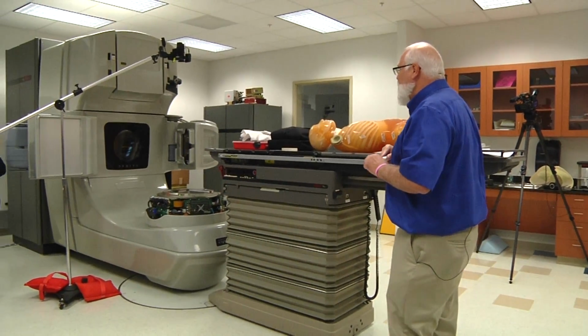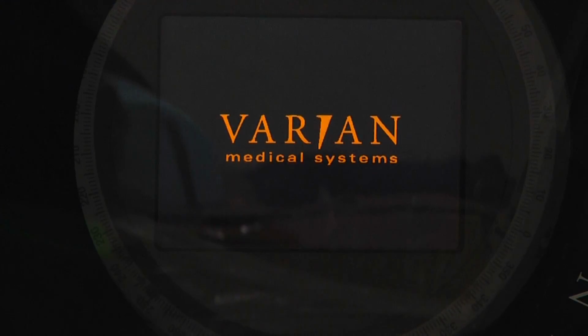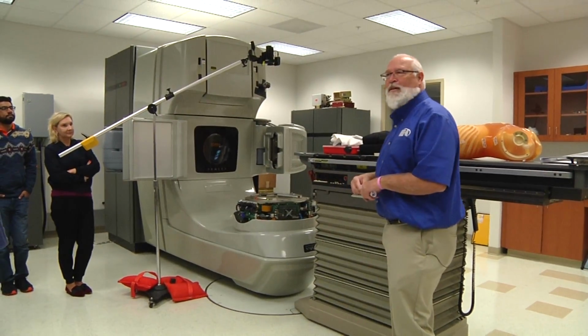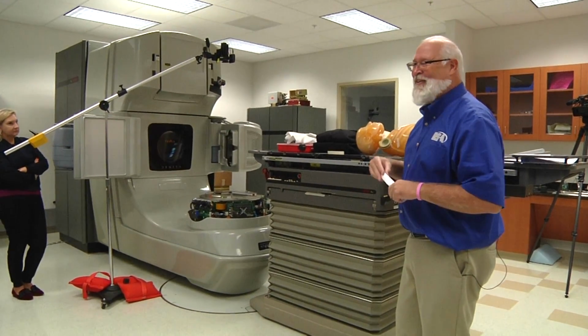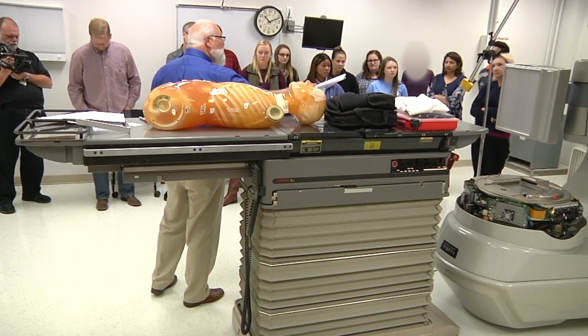One of the things that Varian did is this display in the middle. Someone thought it looked like a pizza, so we call it the pizza board. So your Varian engineers, they're going to say, well, it's behind the pizza board. And you're like, what is that? So that's our lingo. Doesn't always communicate well with you guys. But we'll remove the covers.